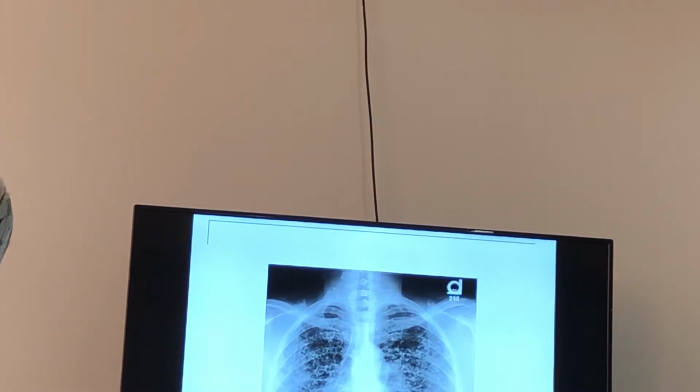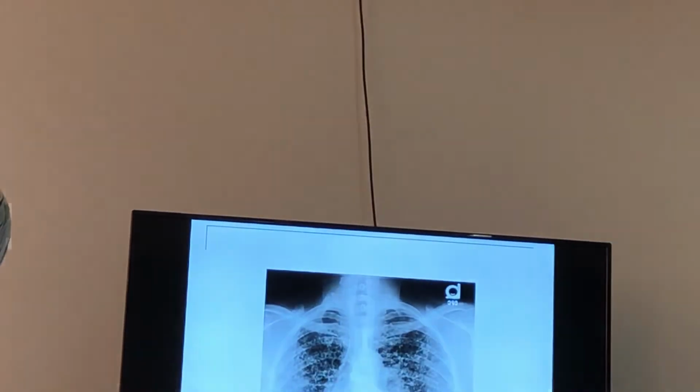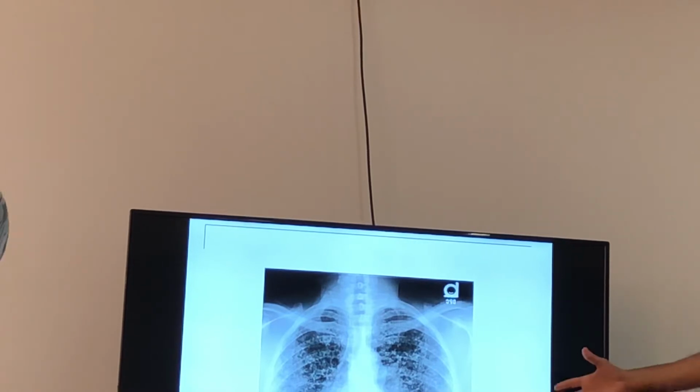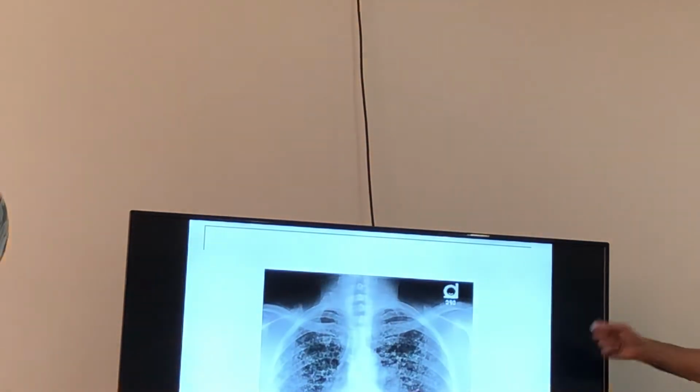This is reticular nodular. It's true. We don't see all of this very often. You always send us cases with reticular nodular. You can't say honeycombing on a chest X-ray. You can't, unfortunately, and you cannot actually use the term on an X-ray. You need to CT the patient. It could be highly suggestive of honeycombing, but you can't actually use the term on X-ray. You can use it on CT imaging. But this is reticular nodular. Usually reticular nodular is diffuse and bilateral. It's a reticular pattern with multiple nodularities, and this is what it usually looks like.